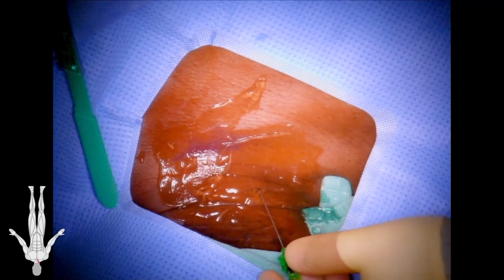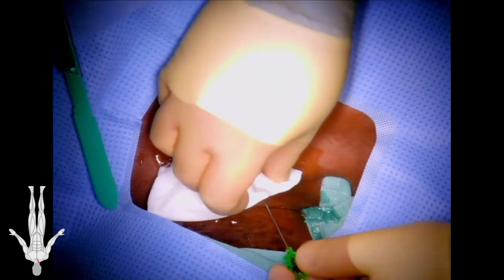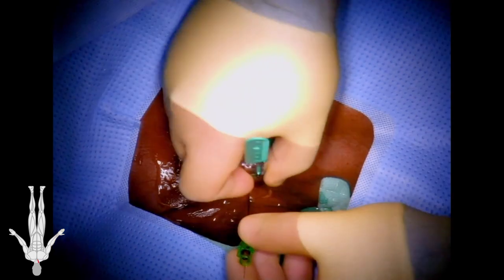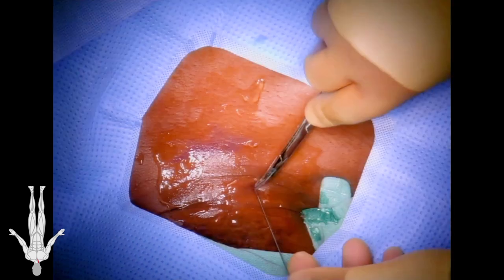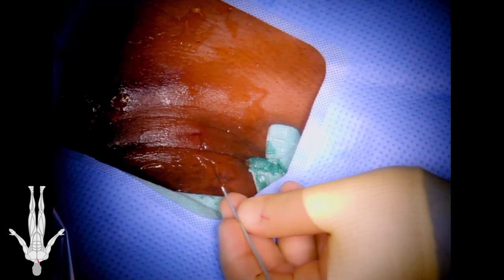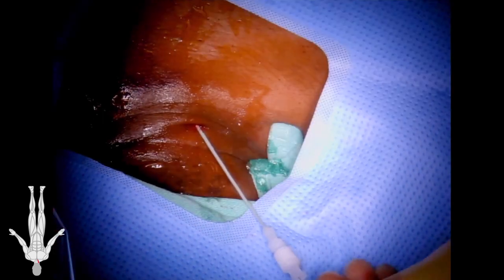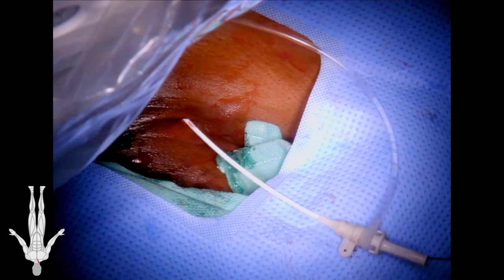The internal jugular vein is accessed under ultrasound guidance using a mini stick needle followed by wire and micropuncture sheath, as shown in this video. The tract is dilated where the needle enters the neck to allow placement of the larger sheath. This is followed by upsizing to a 5 French sheath over the rosin wire.